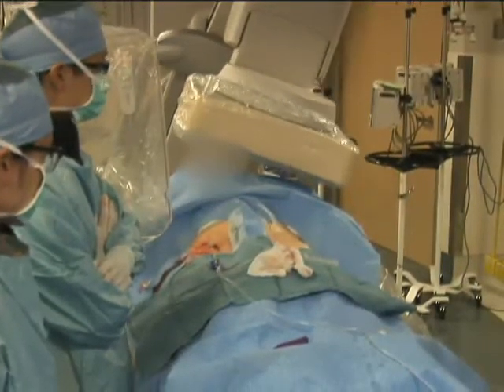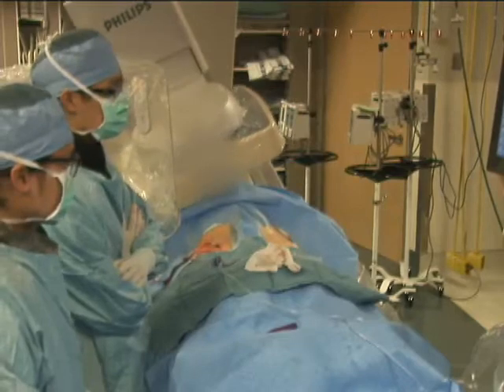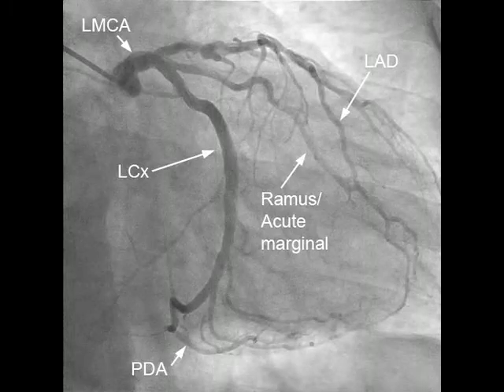After pressure is recorded, the tubing and catheter are filled with contrast, and the left coronary artery is selectively cannulated by both advancement or retraction and clockwise or counterclockwise torque of the catheter. Typically, the fluoroscopy detector is positioned in the LAO 20 angulation for engagement of the coronary ostia.